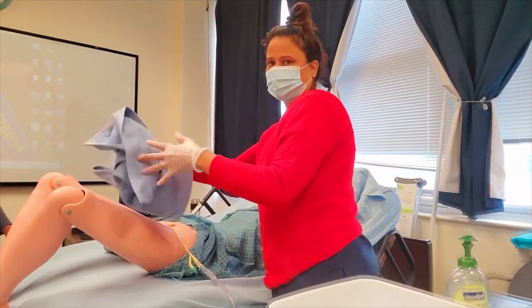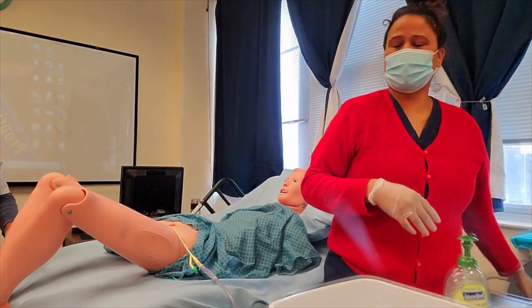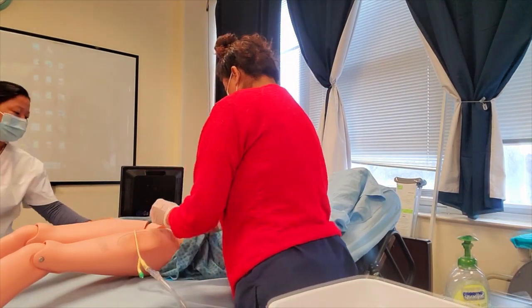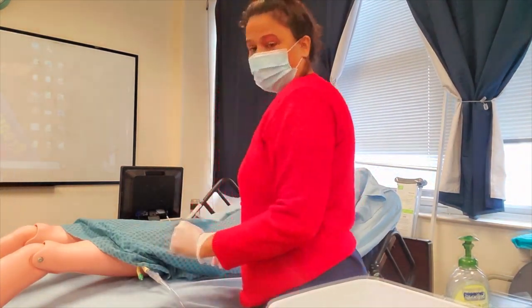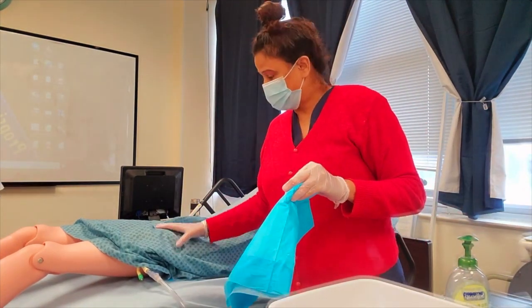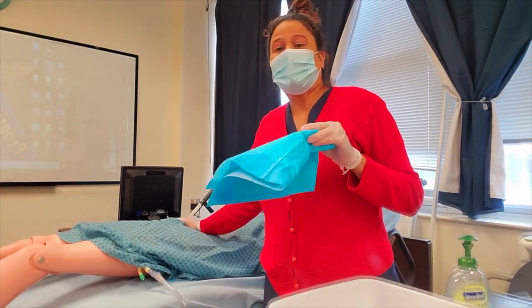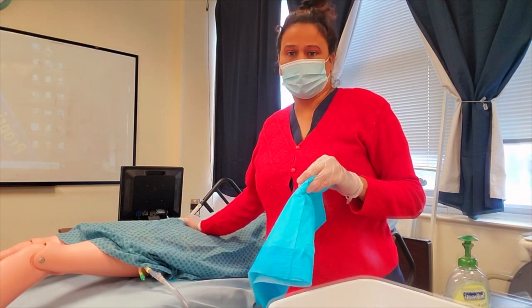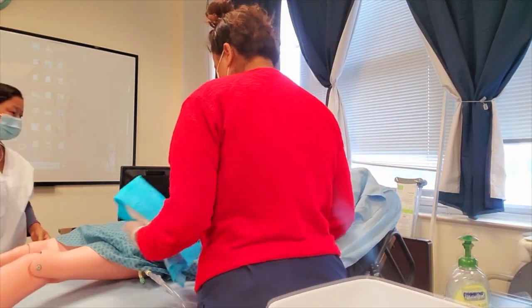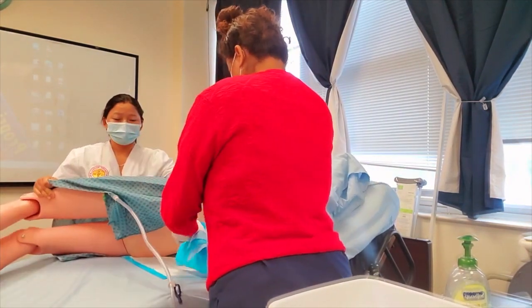Place the used towel into the hamper. We have our patient back in a good position. Now I'm going to change the chuck and put a dry one, because the chuck we had under Mrs. Jones has water on it — it's soiled. We have to replace it. Mrs. Jones, can you turn to the other side so I can replace the chuck?